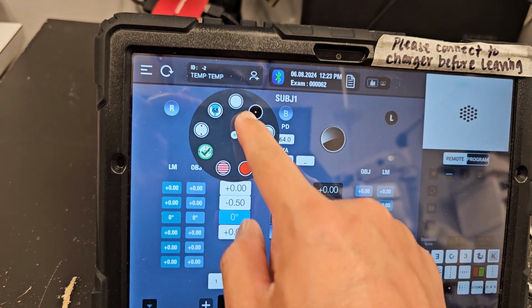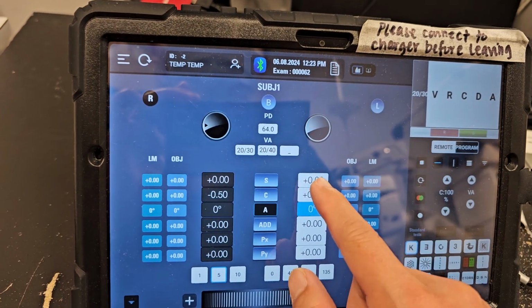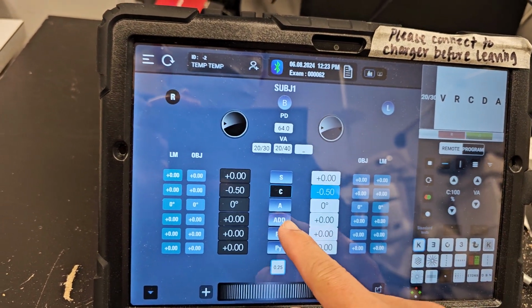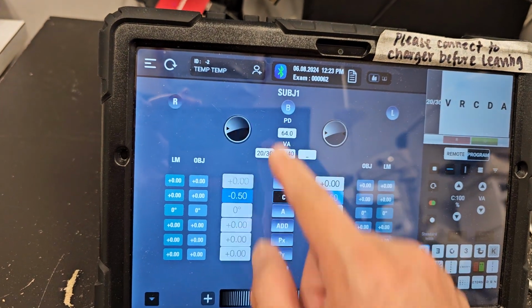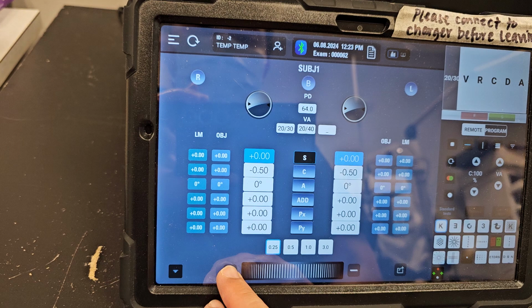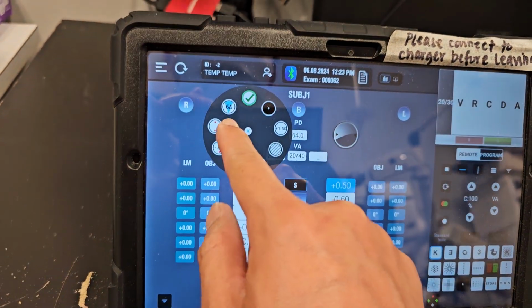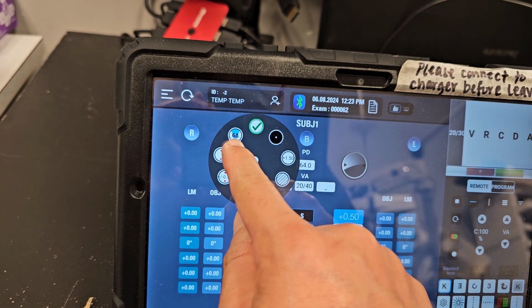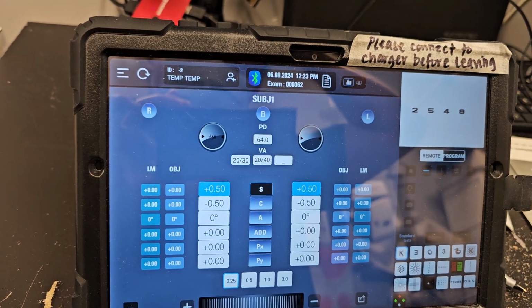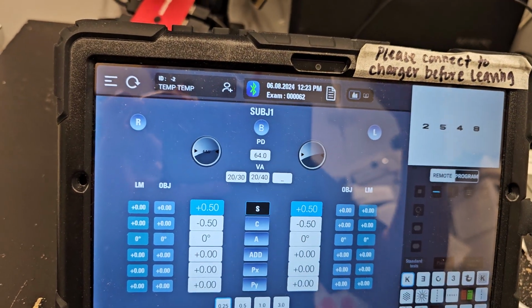And when you're done with JCC, you can go back to the regular mode. And same thing for the left eye. So let's say you finish the left eye, if you want to do binocular balance, you can manually add the plus to the patient, and you can do the 6 base up to separate the 2 lines.